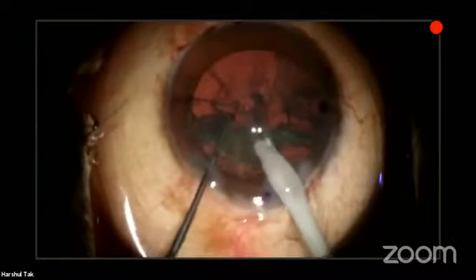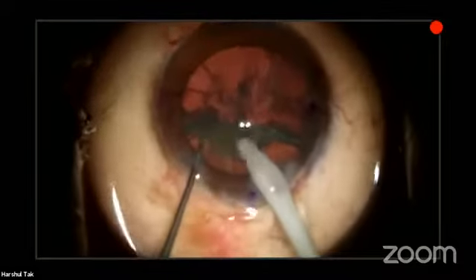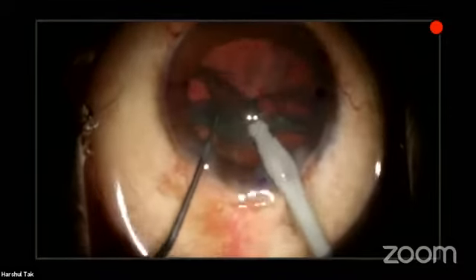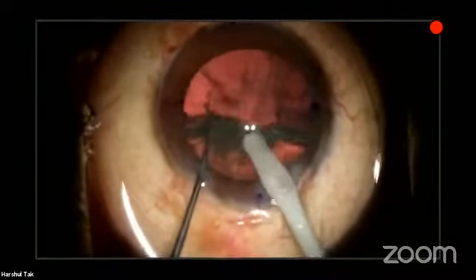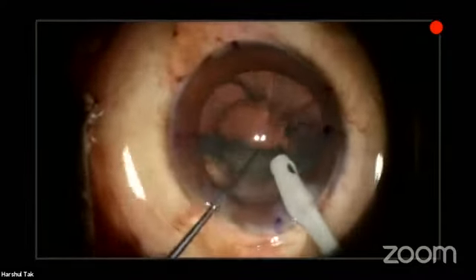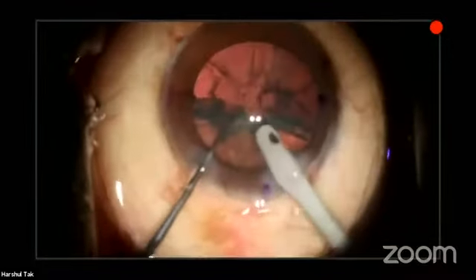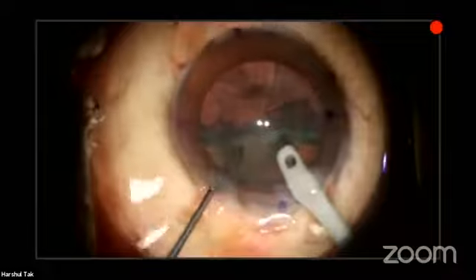So regarding the capsulorhexis, you should always try to be on the smaller side as you can always enlarge the rhexis in the end to get the benefit of complete overlap of the IOL optic, especially in toric and multifocal and trifocal IOLs. So it's very important that you don't have a bigger rhexis in the beginning.